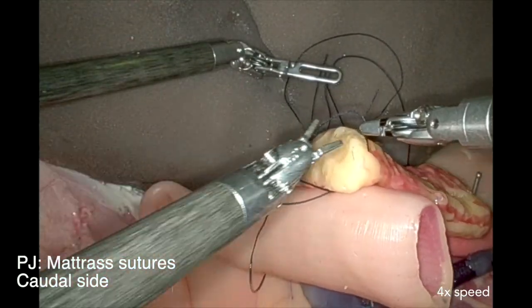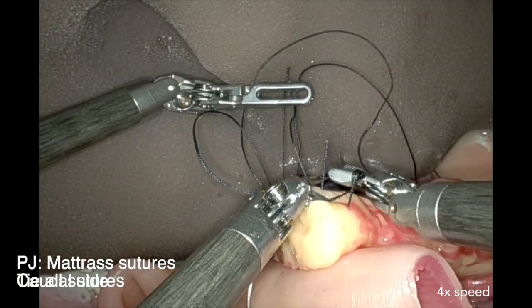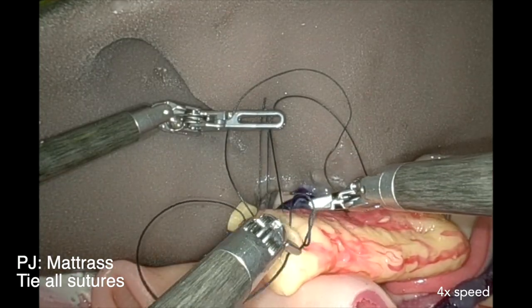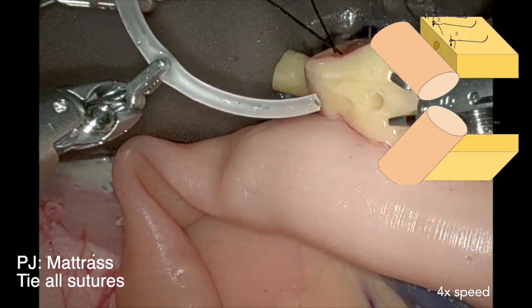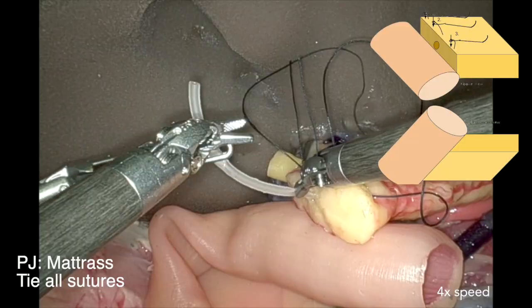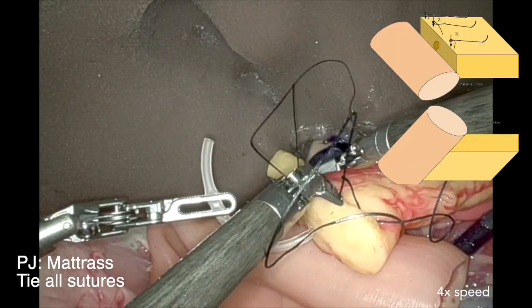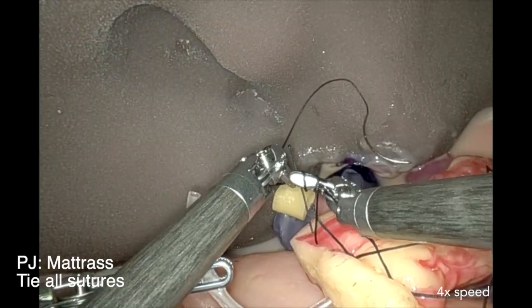After these mattress sutures are placed, we move to the next phase and tie the mattress sutures. Remember not to cut them because we will use them later during the buttress sutures. Before tying the central mattress suture, insert a stent in the pancreatic duct to prevent the duct from closing off by tying the suture too tight. When all mattress sutures are tied down, the bowel will be snugged against the back wall of the pancreas.